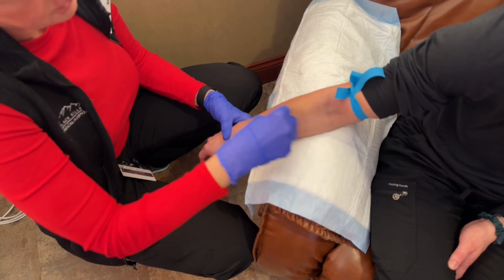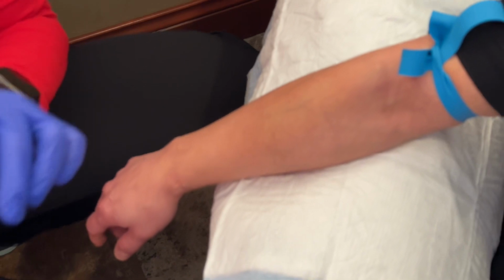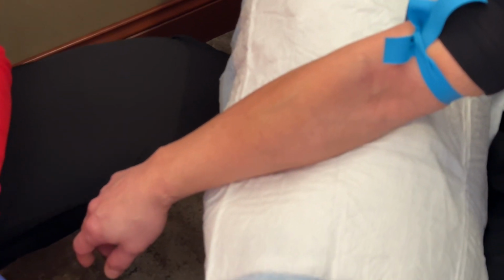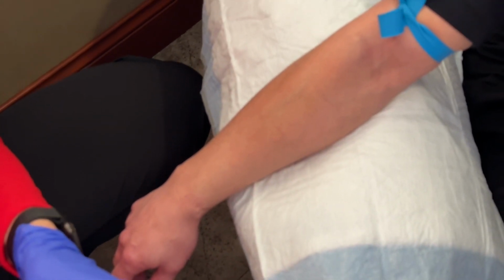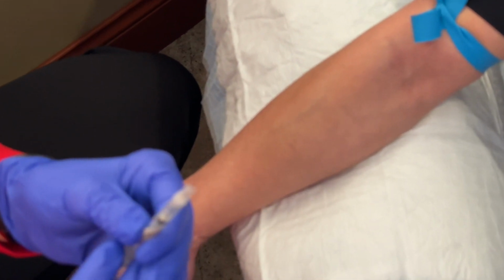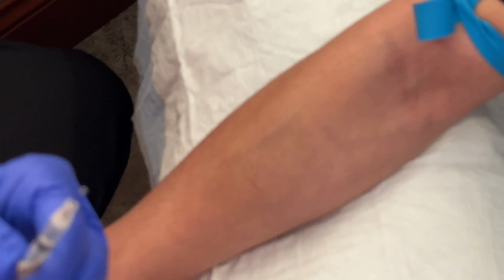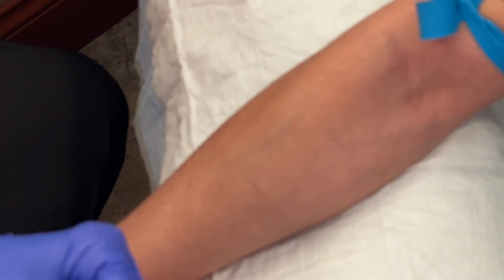You want to obviously clean your area that you're going to use lidocaine on. The purpose of the lidocaine is to numb up the surface of wherever you're going to put your IV. It's almost like a TB wheel. You are going to only use the bevel up, just like as if you're doing an IV.